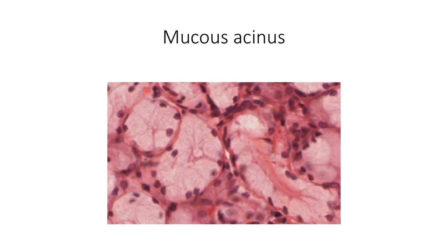Mucous acini are usually tubular in shape. Mucous cells lining these acini are cylindrical in shape with a flattened nucleus at the base. The apical cytoplasm is filled with large pale-staining secretory droplets containing mucin. These mucinogen granules at the apical region are usually lost during preparation of H&E stained sections, making the apical region of these cells appear almost empty.